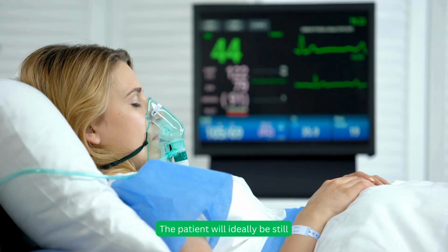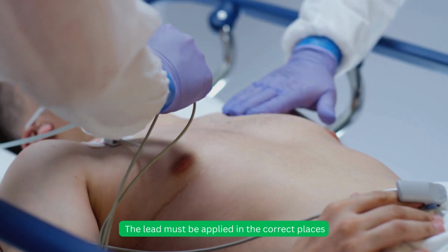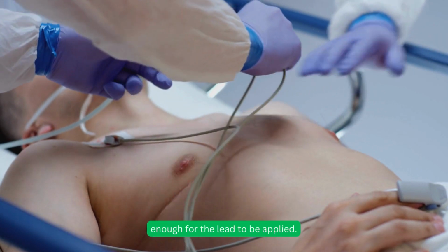ECG procedure. The patient will ideally be still, as skeletal muscle movement will be picked up on the ECG. The leads must be applied in the correct places, with adherence to the skin maximized by shaving the areas enough for the lead to be applied.